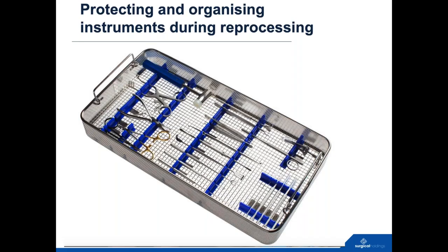I'd personally like to see more from the washer disinfector companies to actually work with the instrument manufacturers to try and come up with better solutions, because I think, as I've said before, like you have on a household dishwasher, you're only washing knives and forks and some plates, but you've got a range of different solutions in there just for those basic devices to ensure they're clean. So surely we can collaborate and come up with something that will be suitable for even 4,000 instruments.